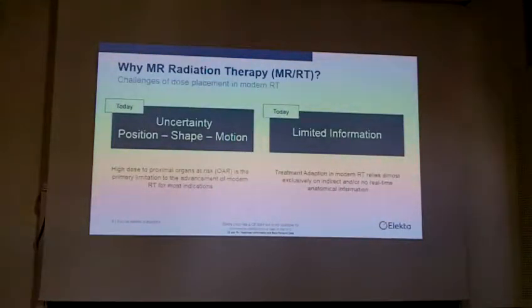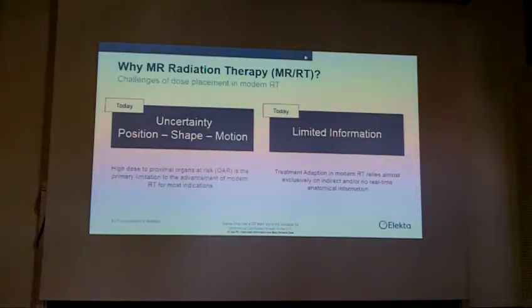Also, a main problem regarding the organs at risk is that as you extend your PTV, the organs at risk will also be irradiated higher, and that's also a problem.